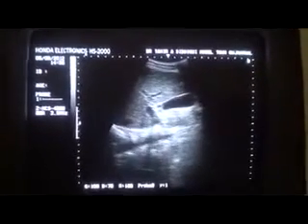With patient in supine posture. Now you will place the probe available. You will get this with patient supine and placing the probe just above the intercostal space in the sixth or seventh intercostal space. This is the subcostal region, and this is the intercostal space, and then you angle the probe a bit, angling towards the left shoulder of the patient, or angling a little bit.